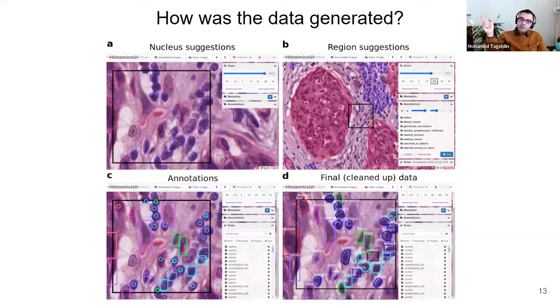Let's say they are now annotating all the lymphocytes in this field. They will change the classification default mode, and then they just click all the lymphocytes. And again, this suggestion doesn't carry over. This is just for them to see in the background. They still have to place their dots just to confirm or not confirm that they agree with this. And then let's say the boundary is pretty messed up. Like here, these are two different nuclei that the initializing segmentation boundary didn't really separate. So what they end up doing is that they place bounding boxes.